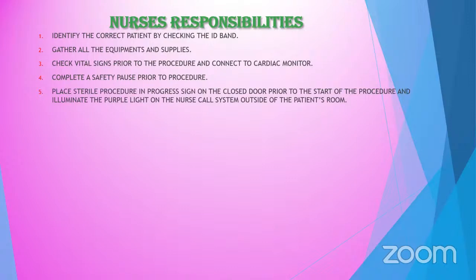Then fifth, place the sterile procedure sign on the closed door prior to the start of the procedure and illuminate the purple light on the nurse call system outside of the patient room. This means that we should put a signboard that a sterile procedure is ongoing, so no one can enter the room if they are not wearing the proper PPE. Proper PPE is gown, mask, gloves, complete sterile PPE.